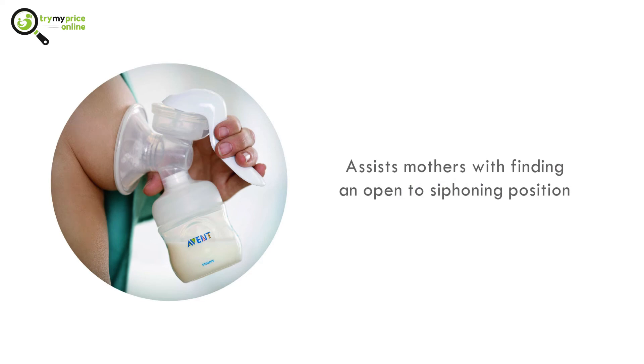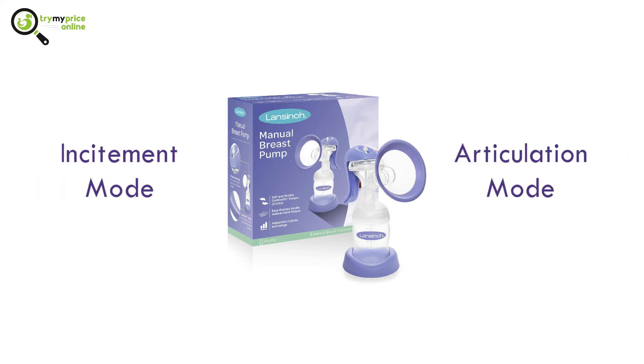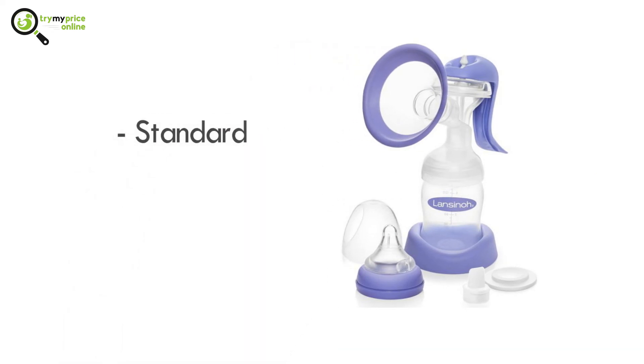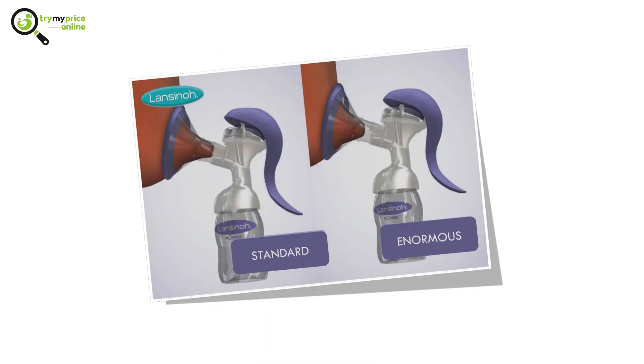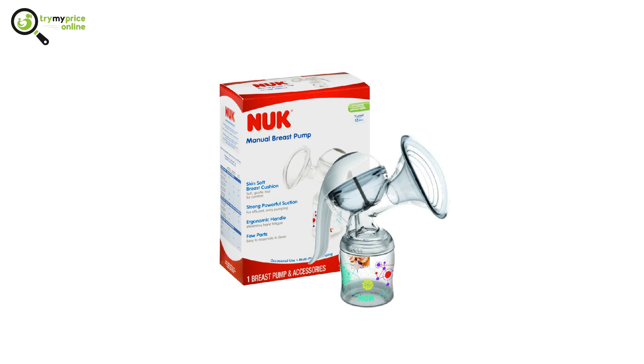Number 4: Lansinoh Manual Breast Pump. This pump utilizes two unique modes: a stimulation mode and an expression mode. It has breast shields that fit two sizes — both standard and large — which will assist mothers in finding the correct suction level that will work for them.